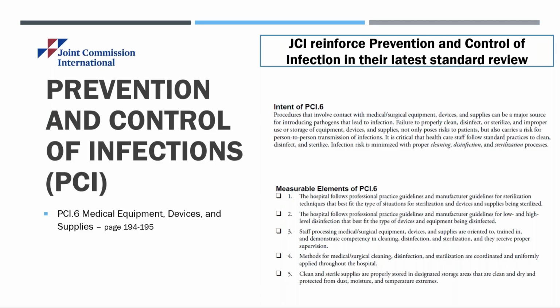They then go on to give you a number of guidelines: follow the manufacturer's guideline for low-level and high-level disinfection, and follow professional guidelines, which I've already mentioned, that a device that touches the mucous membrane requires high-level disinfection. Also, that you follow appropriate methods for cleaning, disinfection, and sterilization, and these are coordinated and uniformly applied throughout the hospital. And then once the device is cleaned or disinfected, it should be properly stored in an area that's clean and dry, protected from dust, moisture, and temperature extremes.